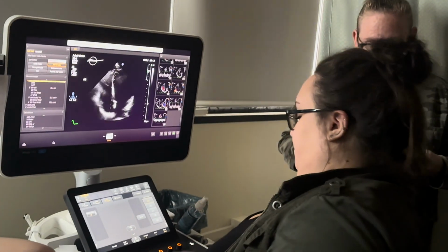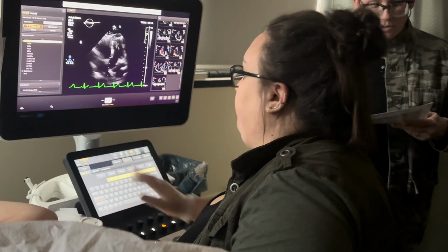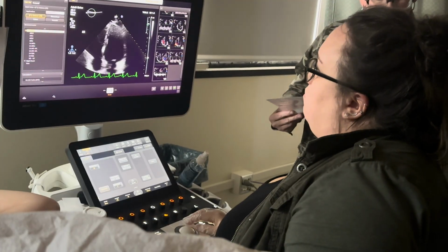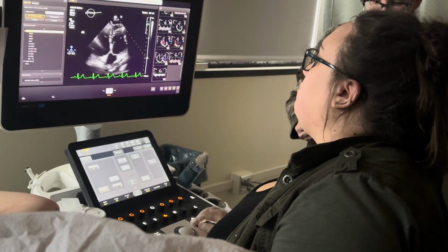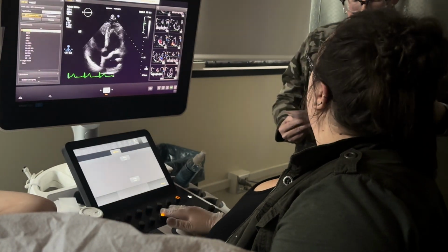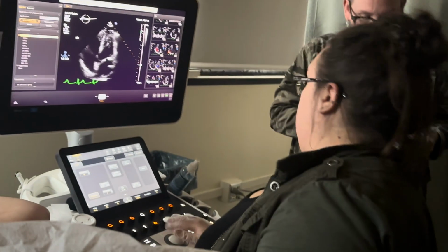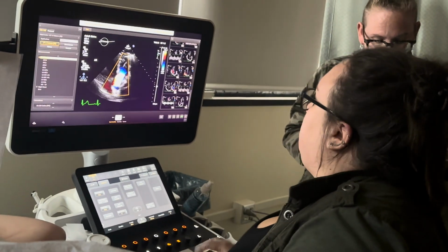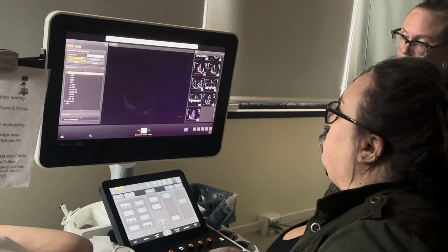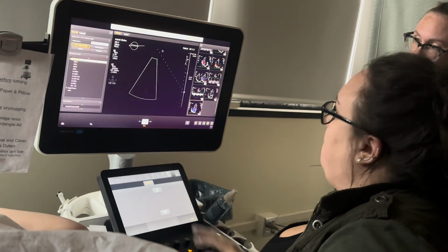Is that it for 2-chamber? Oh, and then 5. Yeah, what I meant. You gotta go on to 5. I was thinking in my head, it's okay. 2-chamber. 5 color, LVOT, AV VTI. She only wants an AV VTI, not an LVOT one? She wants an LVOT pulse wave, but she only wants an AV VTI. That's fine. I can do that. Read on whatever storage. So, got a little bit of insufficiency or regurgitation there.